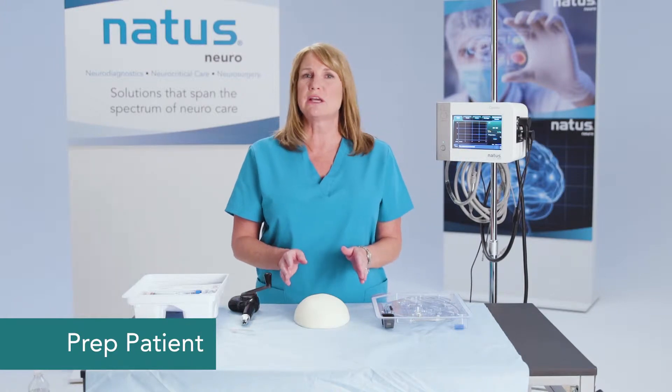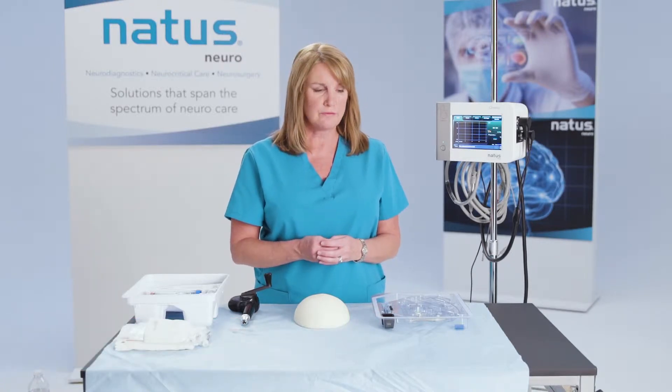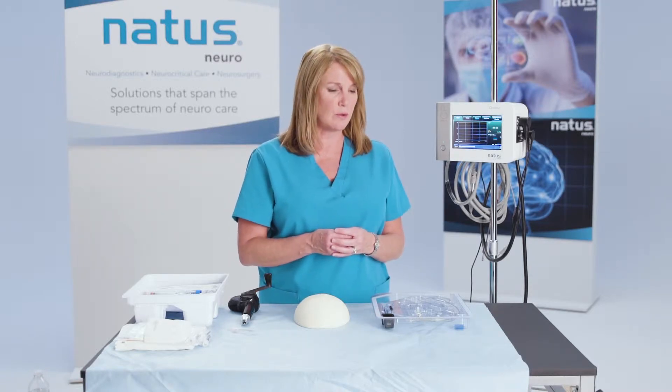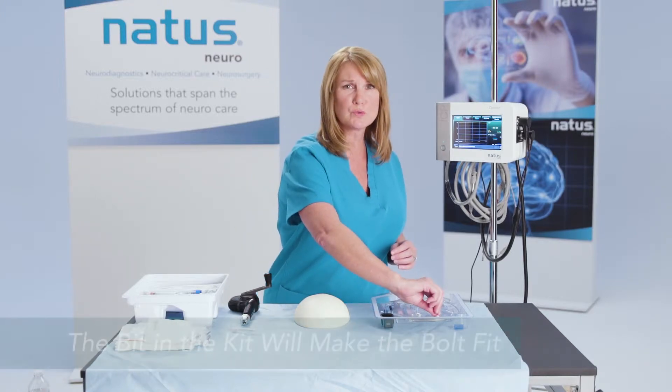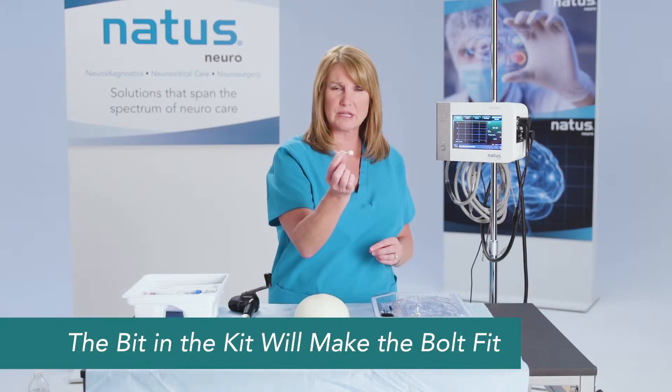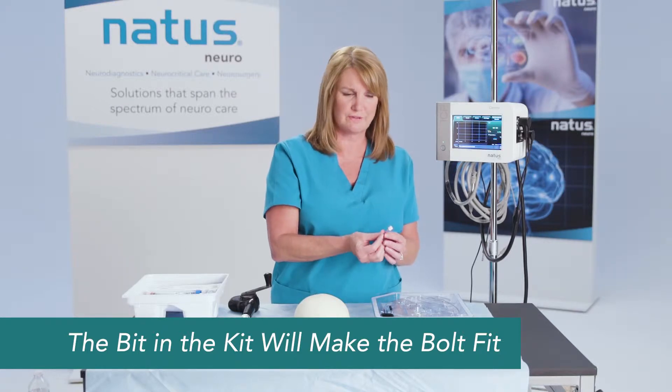You'll prep the patient like you normally would and find the landmark where you want to access through the skull. The first thing you're going to want to do is make your stab incision through the scalp, and then you're going to need to open up that skull. You want to use the drill bit that comes in the catheter kit — the bit in the kit will make the bolt fit.